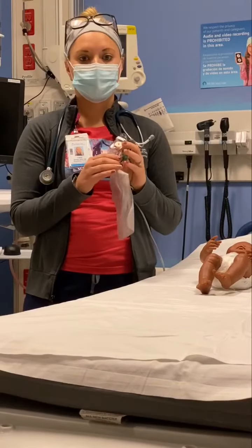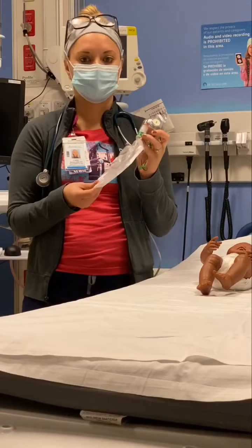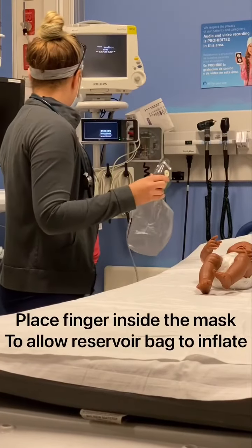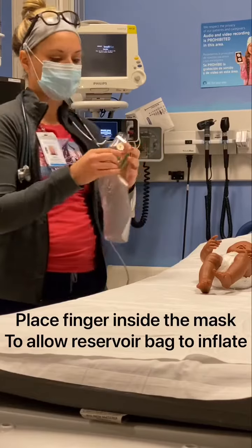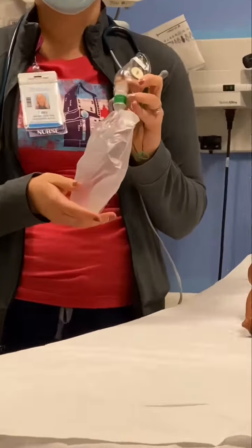Oxygen flow into the mask may be adjusted to prevent collapse of the reservoir. So you just want to turn it on and place your finger inside the mask to inflate the reservoir.